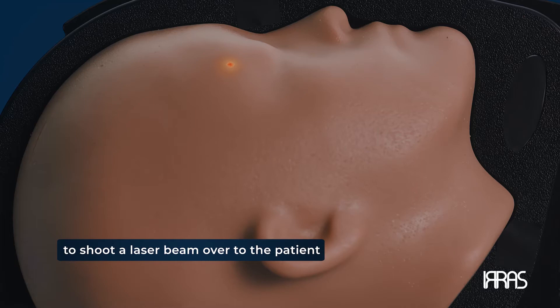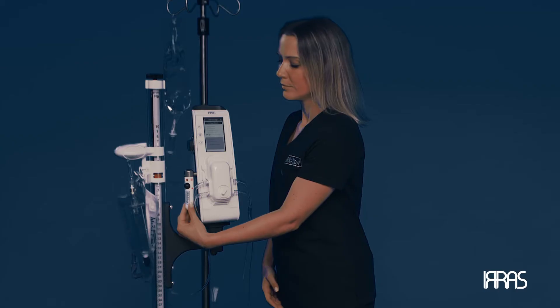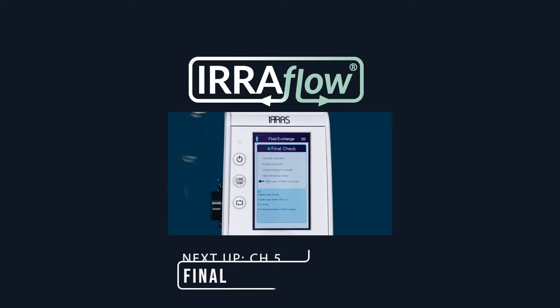This will allow you to visually see where the control unit needs to be positioned. Typically, the zero point of the control unit transducer is adjusted to the tragus or the lateral eyebrow.